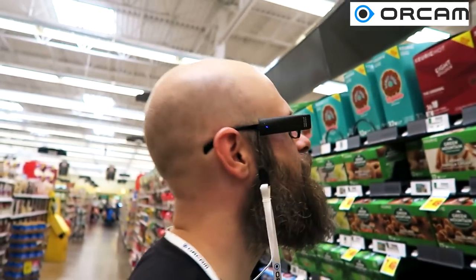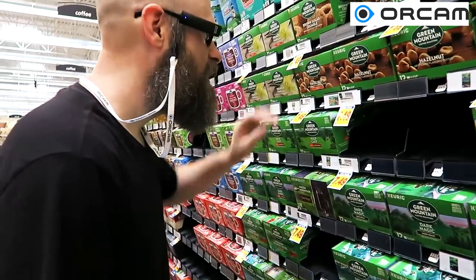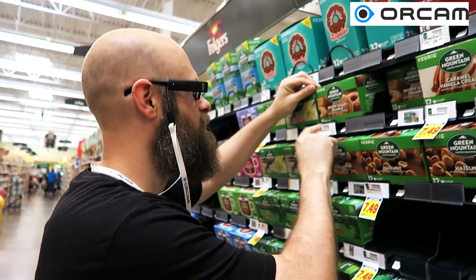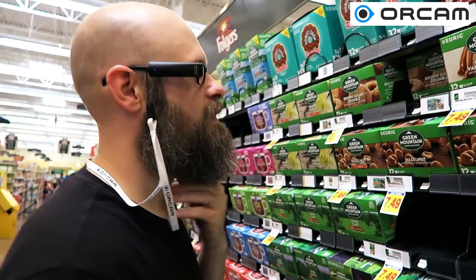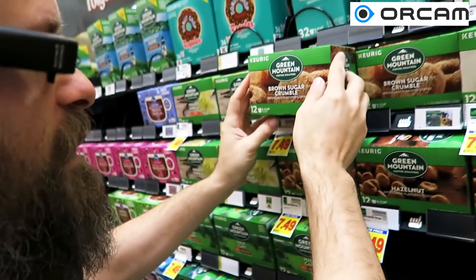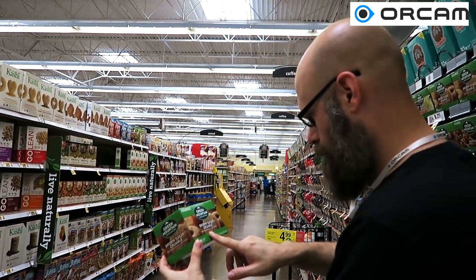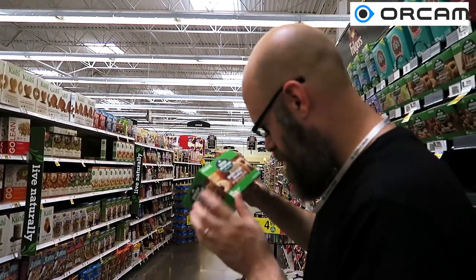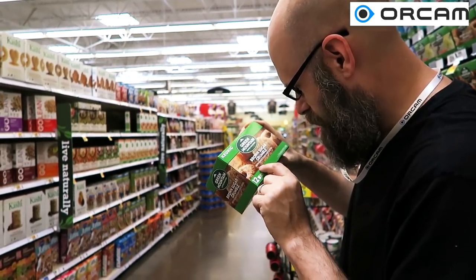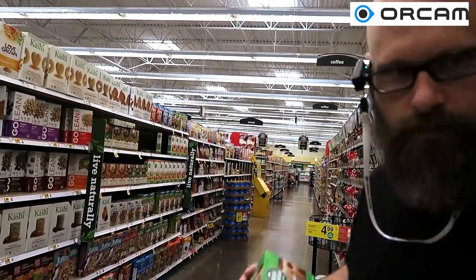It read a clock — says it's eight o'clock. Okay, so it read a clock. Let's try something else. It said 'artificially flavored G' — actually, artificially flavored coffee. So now let's try taking it away from all that and see how well it reads. It says brown sugar crumble and then artificially flavored coffee. Let's try just taking a picture this time — brown sugar crumbled savor. That actually sounds pretty good.